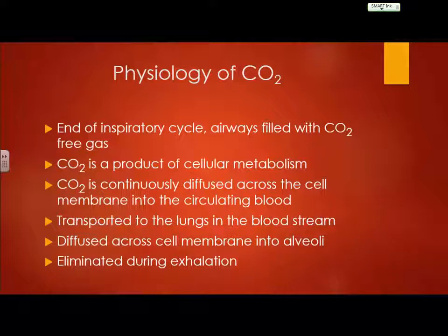Now, why is that thrown in here in relation to CO2 monitoring? Because it's going to be baseline, it's going to be zero. So that's going to give me the indication that I'm breathing in, right? When I've got a flat baseline. When that CO2 starts to diffuse across the alveolar membrane and starts to come out of the bronchioles, then we're going to start seeing that peak, or we're going to see that rapid incline of CO2.